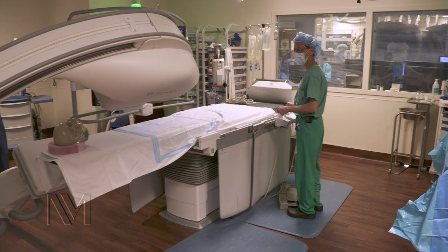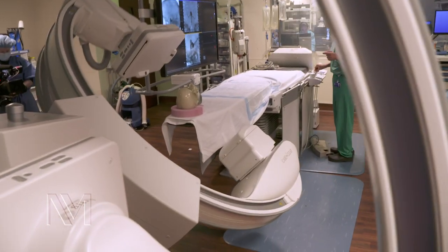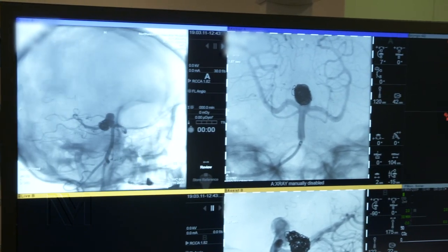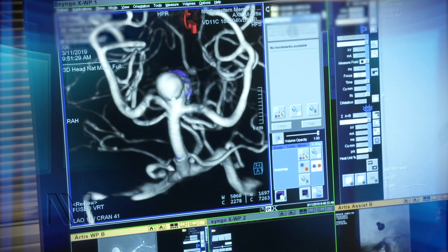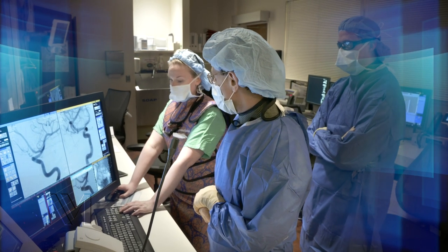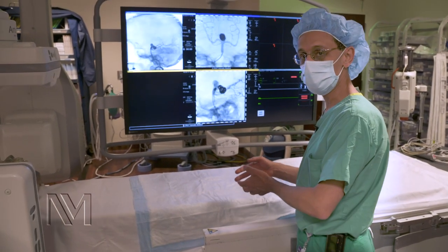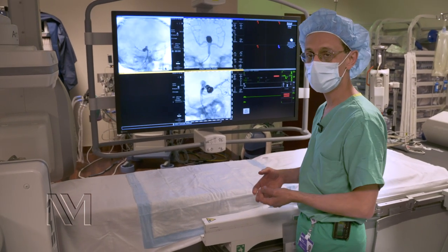We're going to use the rotation of this C-arm to spin around the patient's head, acquiring extra images at multiple angles, effectively forming a 3D data set. That data is fed to the computer, and based on that we can explore where an area of leakage or blockage would be, and then measure what devices we need to implant to repair that or to pull a clot back out. We'll gain access to the patient's circulatory system using either a femoral artery access or a radial artery access.